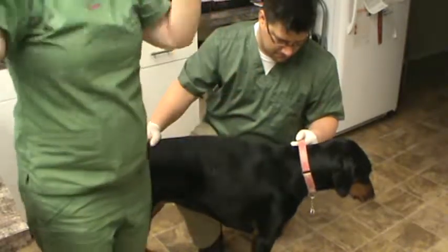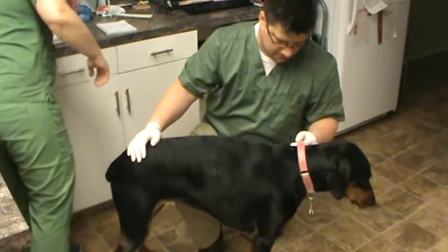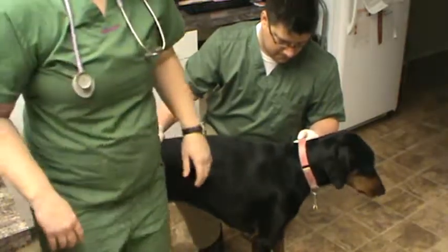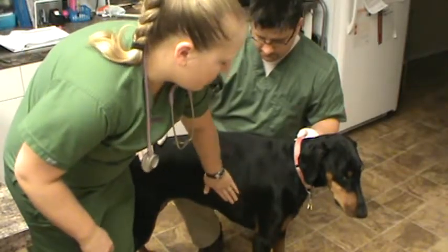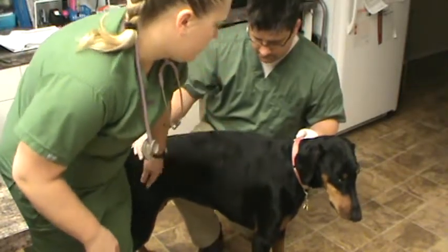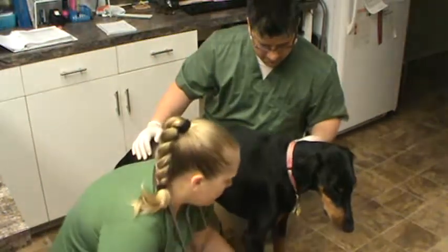Okay, so I listened for 15 seconds and our heart rate was 15. So 15 times 4 is 60, so she has a heart rate of 60 right now. I was listening on this right side over the tricuspid valve and I got a nice clear listen. I'm going to go ahead and check the front feet.